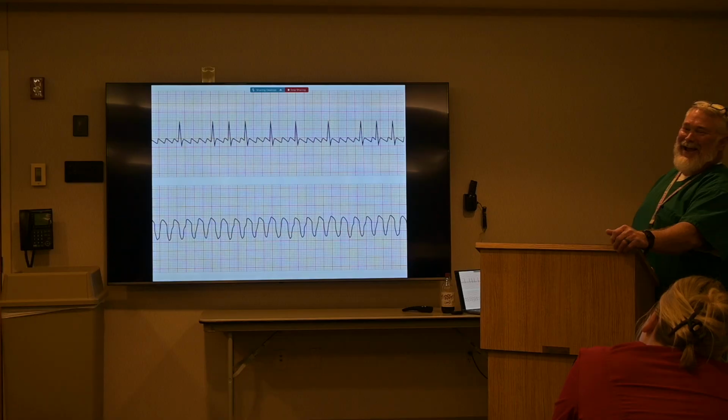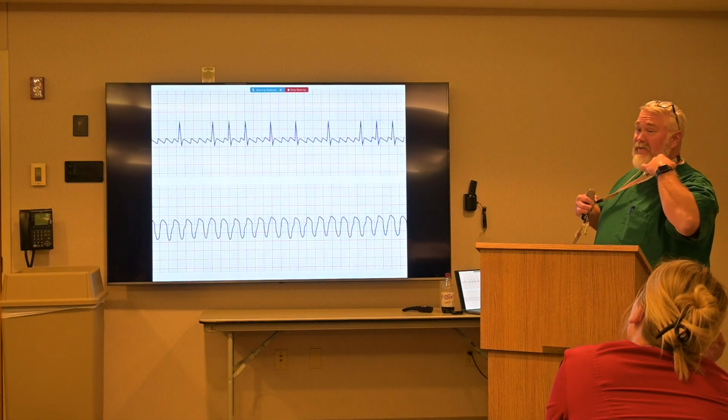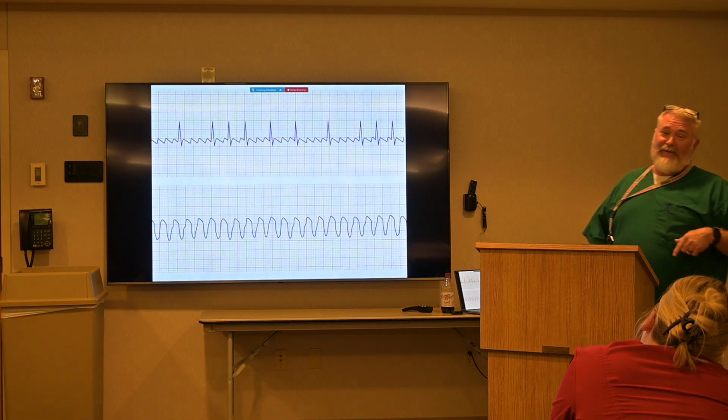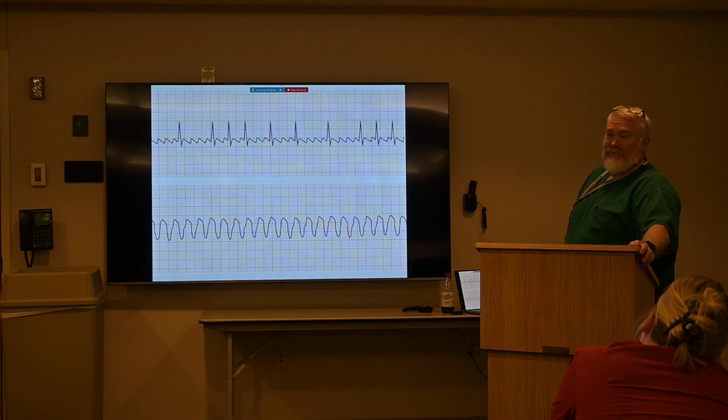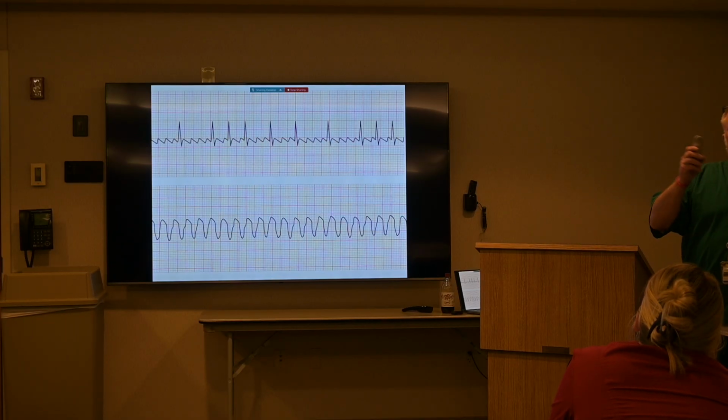Clear! Would you sync it? That's a good question. Would you do synced or unsynced? I ain't poking no buttons. That's the provider's job.